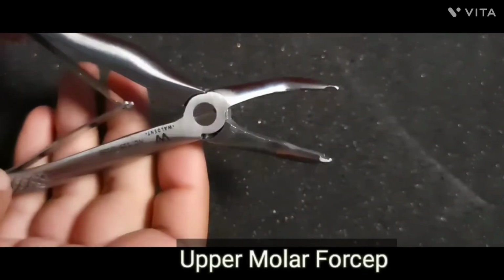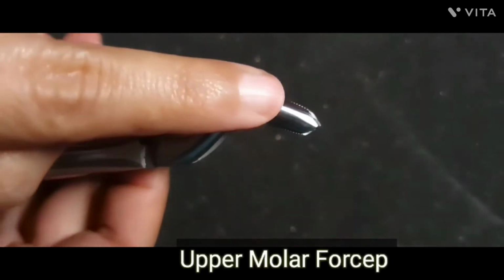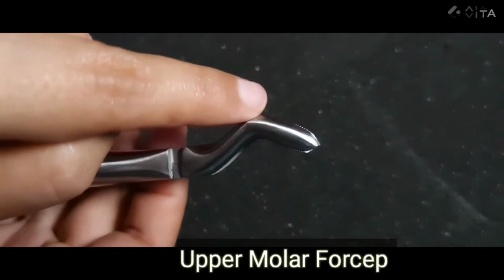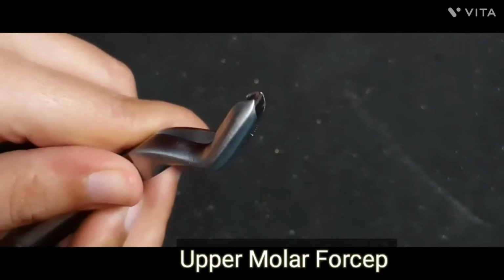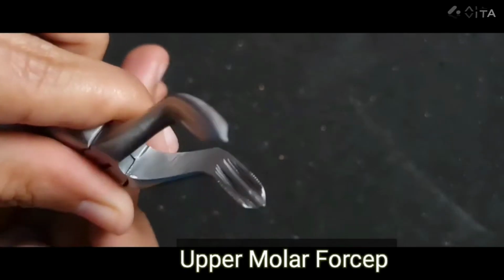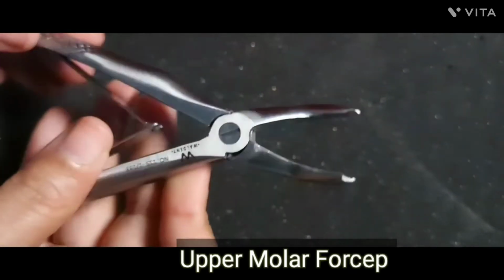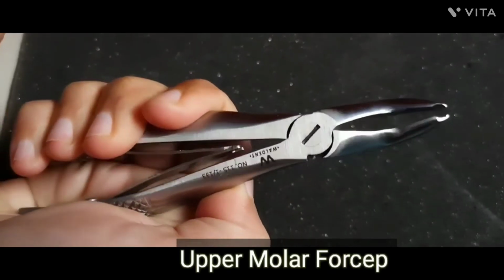The next one is upper primary molar forceps. This forceps can be identified by the arrow or pointed beak. This is for engagement of the upper molar teeth. Expansion of the socket is required for a molar, and you can easily distinguish it from the beak. You can identify it from a pointed or arrow beak, because the upper primary molar has splayed roots.